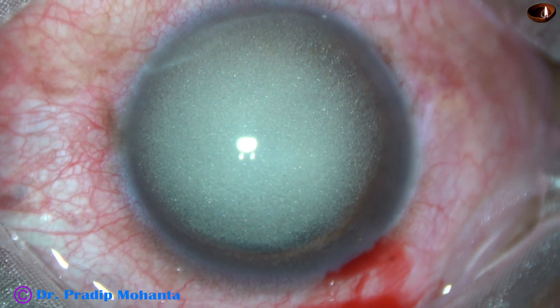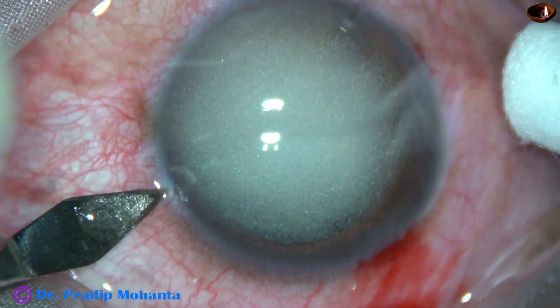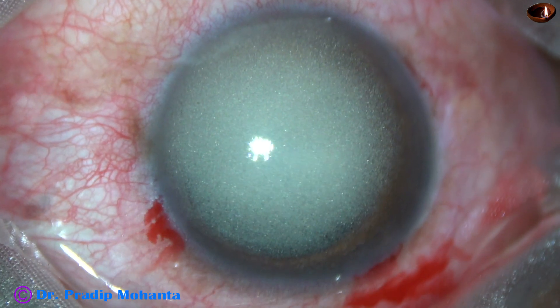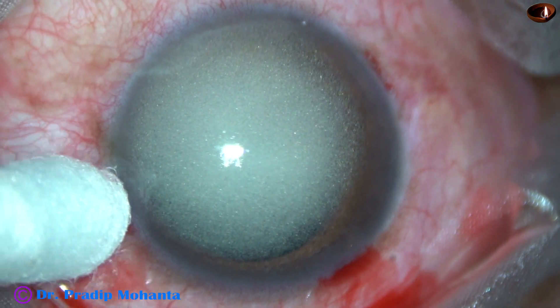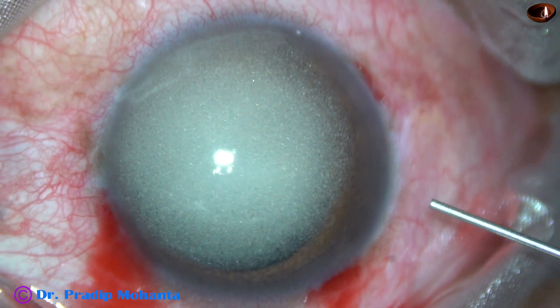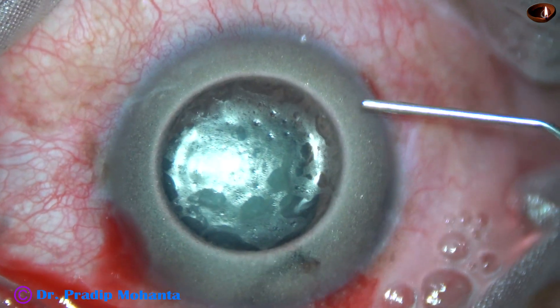The patient has developed a white mature cataract. Today's plan is to remove the cataract, implant an intraocular lens, and then hand over the case to the vitreo-retinal surgeon who will remove the silicon oil. By this time all the incisions have been made, and now I am going to stain the anterior capsule of the cataract with trypan blue dye.